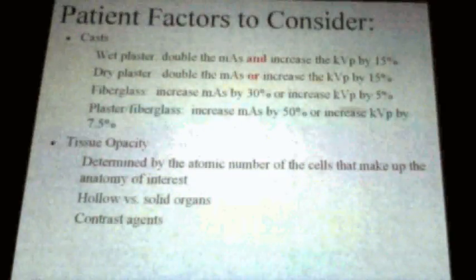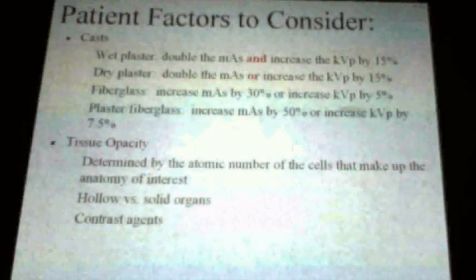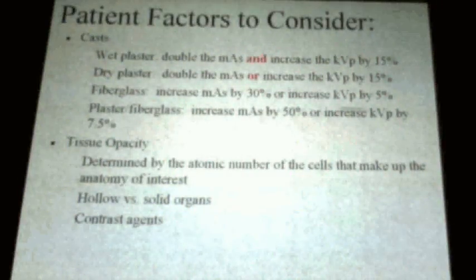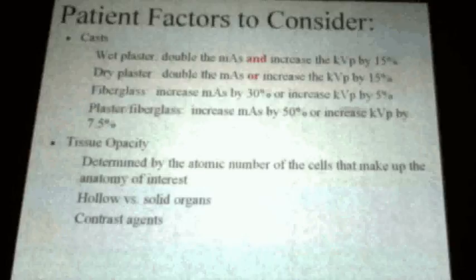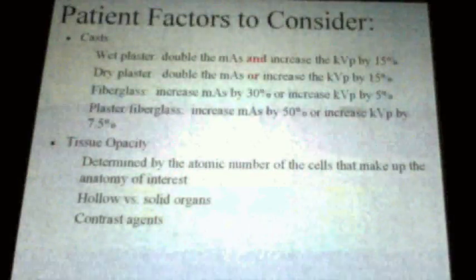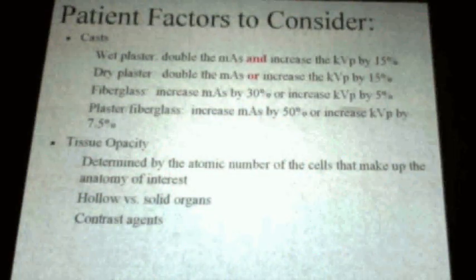Gastrografin. Okay, Gastrografin is a good one. What about the injection? What do they use for that? The dye. What's in it? Iodine. You could just call it iodinated contrast material, that's what they call that. It's got iodine in it. It's clear, they inject it for IVPs, they inject it for a lot of different things. But we'll mostly see it used for IVPs, and they use it for anything in a blood vessel.